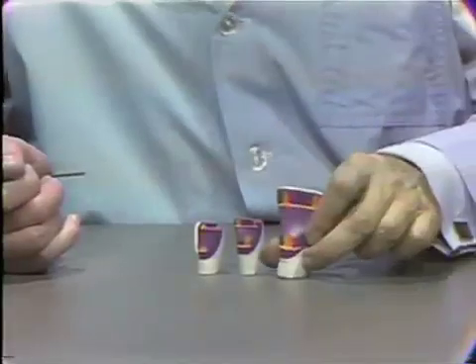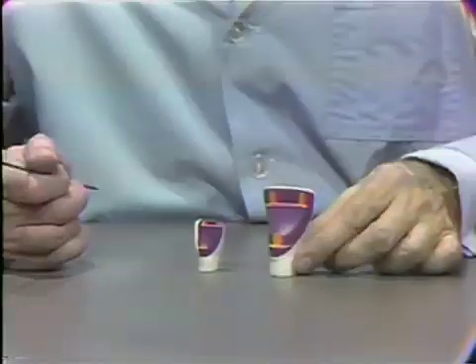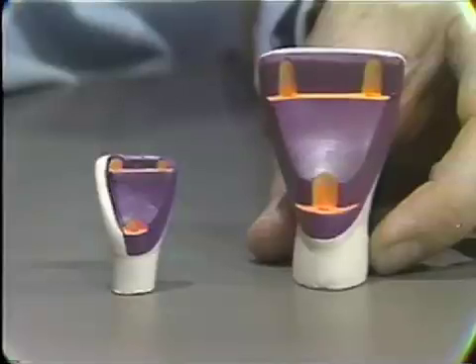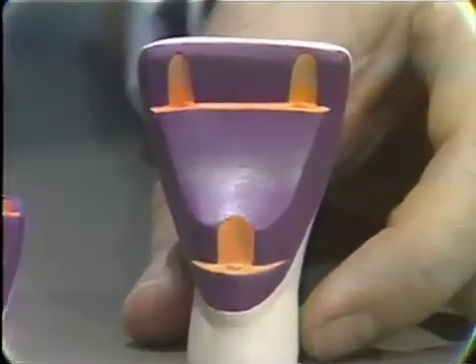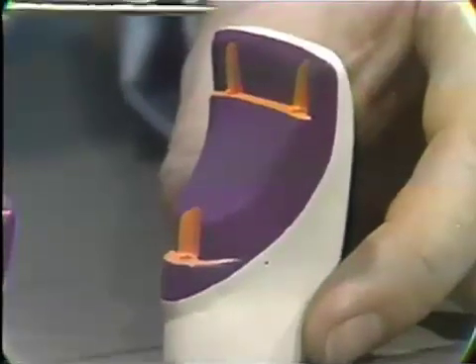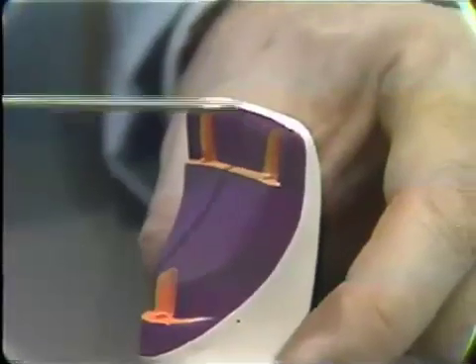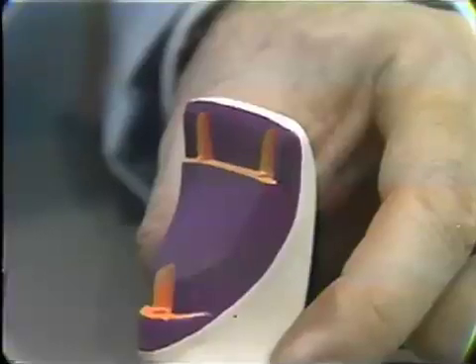The pin ledge preparation can be used on mandibular incisors with equal facility, and leads to preparations of this type which you see here. Here's a bilateral pin ledge preparation on a mandibular incisor. Slightly different shape because of the slightly different shape of the mandibular incisor. The degree of protection of the incisal here can be modified from this one, which is minimal, to one in which it comes as far over the incisal as you may wish in any particular case.